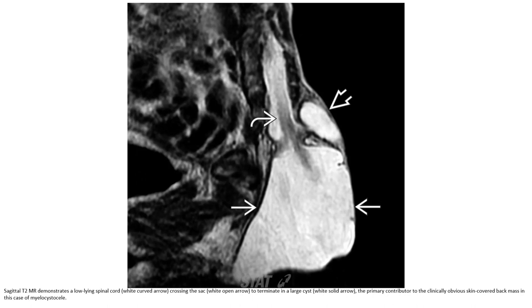This is a sagittal T2 image demonstrating the low-lying spinal cord crossing the sac to terminate in a large cyst. In this case, the primary contributor to the clinically obvious skin-covered back mass is this case of myelocystocele.